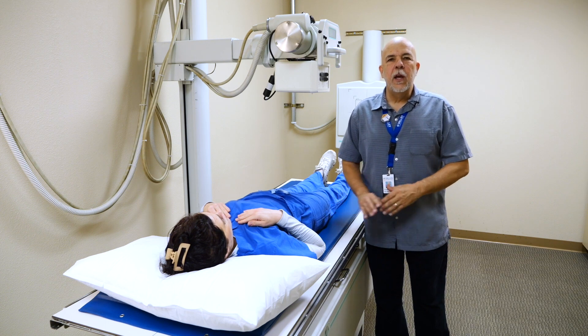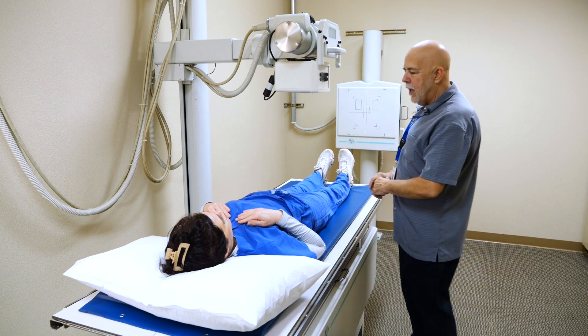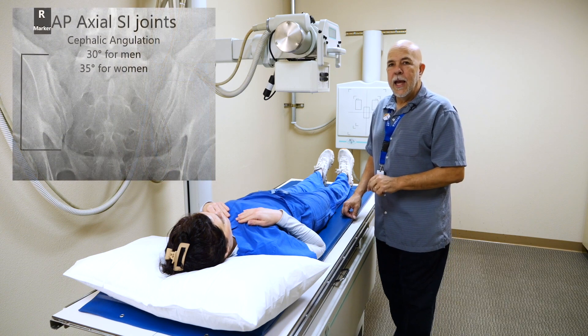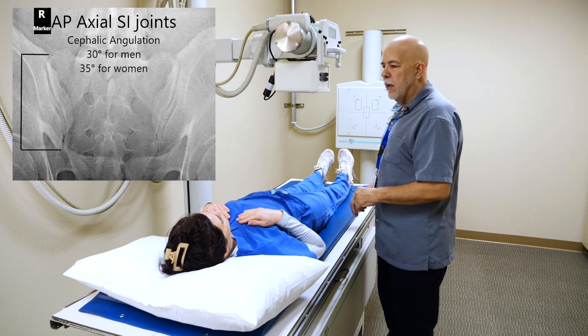Today we're going to do a short video on the SI joints. Robin graciously has been our patient again today. The AP axial sacroiliac joints — you're going to do 35 degree cephalic angulation for women, 30 degrees for men.